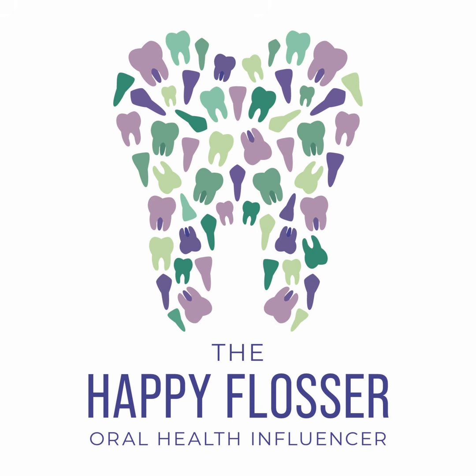But as a result, when I start mixing it, you'll notice that I am going to go a little quick because I only have so much working time. This will really help the patient understand what you're doing and why maybe you change your tone or momentum in that moment. They know that you're under the gun and that you have something that sets up quickly. So they'll be part of the helpful process as long as you communicate that to them.